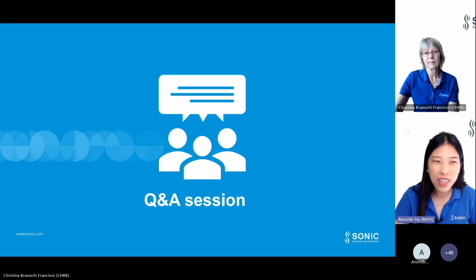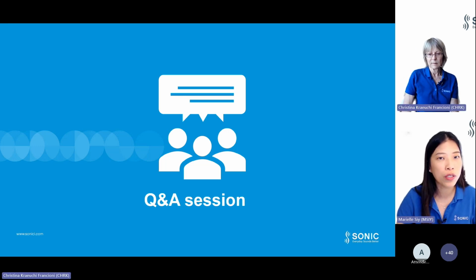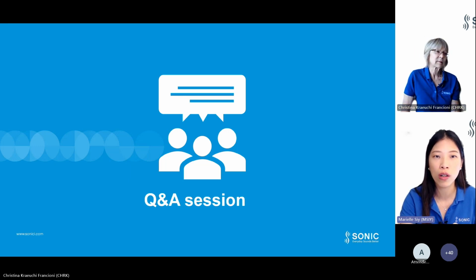So you can tell your patient it will be better to do any phone calls indoors, and hopefully the person at the other end of the line can also benefit from this better audio quality.